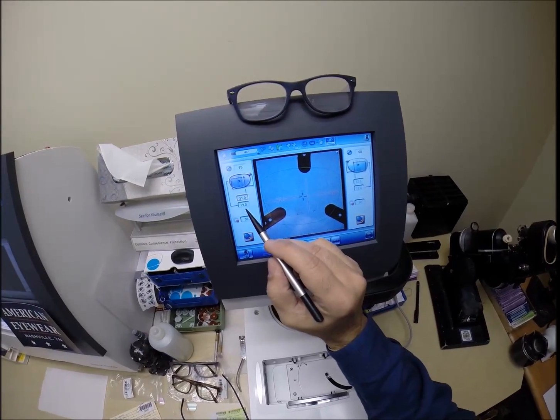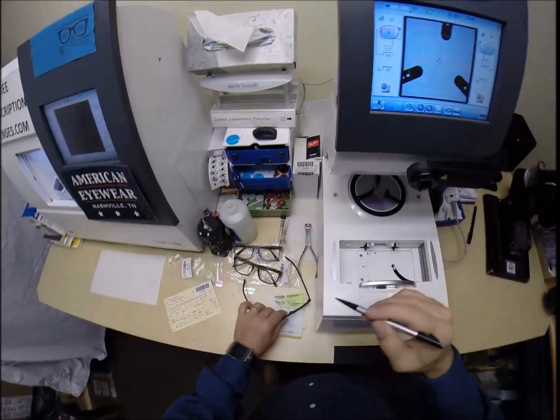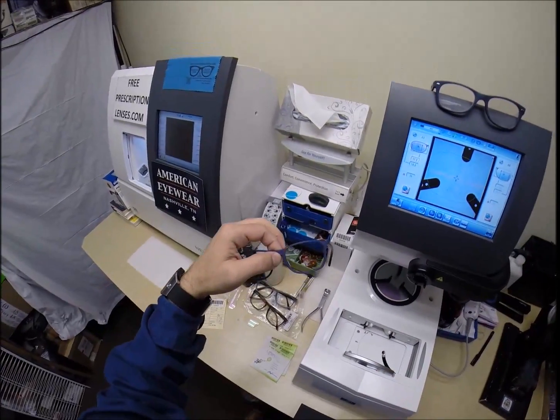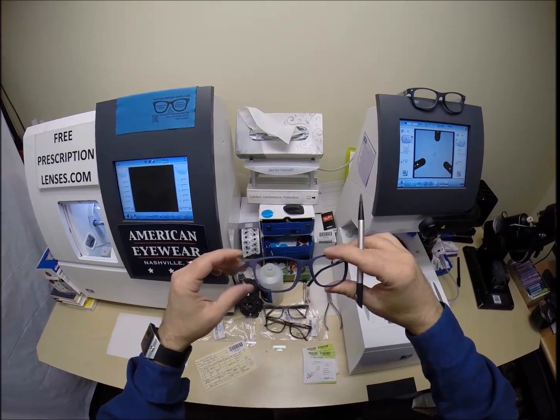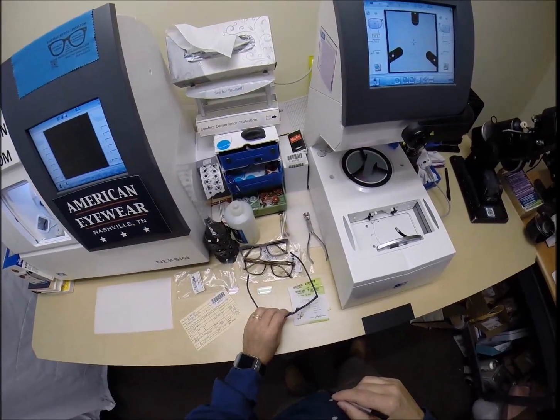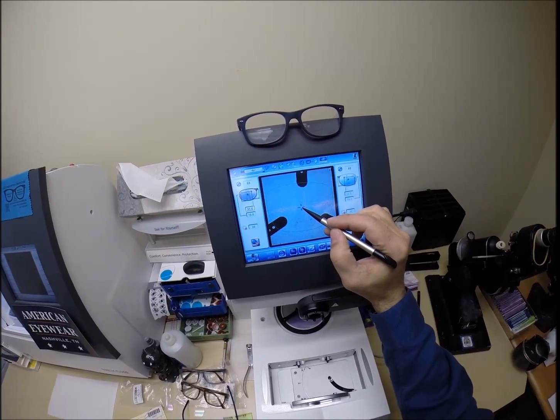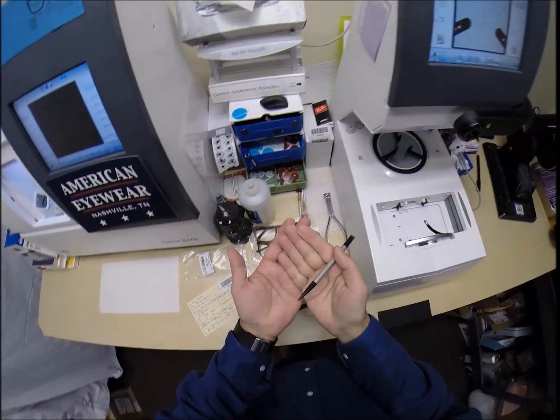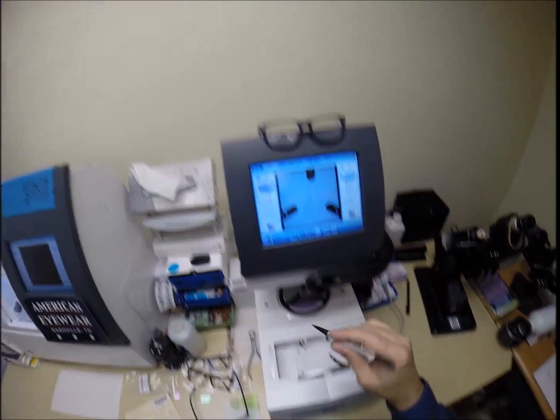Okay, kids, here's something new optically. Normally I would raise the optical center height up because you're looking through the top quadrant of the frame, but these are reading glasses for all the paperwork he has to do when selling houses and all that other stuff. I have no idea what he does, but it's a lot of paperwork you have to go through. And so I'm going to keep the optical center in the center of the frame because a lot of times he may be looking downward at a laptop or looking downward to read paperwork. So I'm not going to adjust that. I'm going to keep it in the middle of the frame.